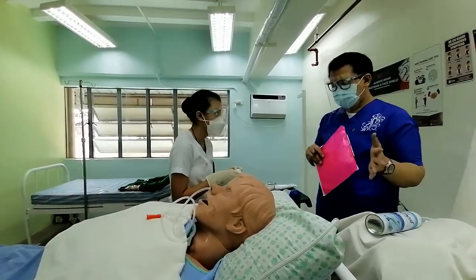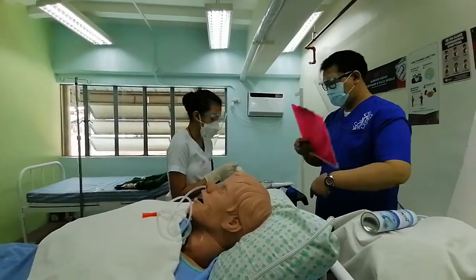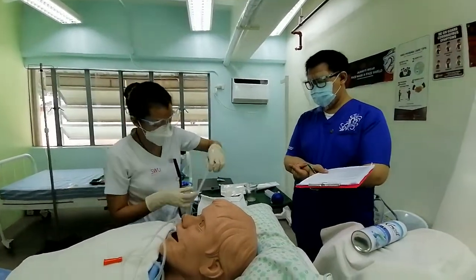Every time you identify the equipment, that's the time that you're going to prepare while enumerating, prepare the tape. Sakto na siya pataas.